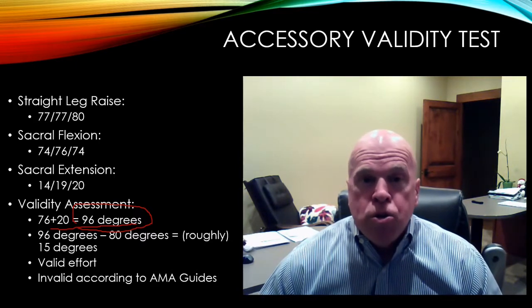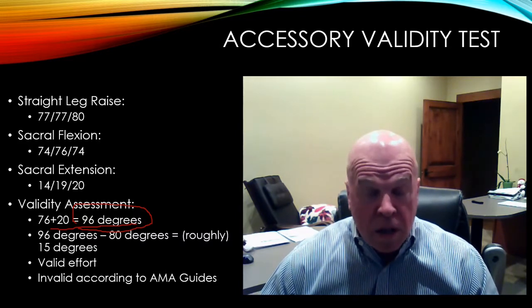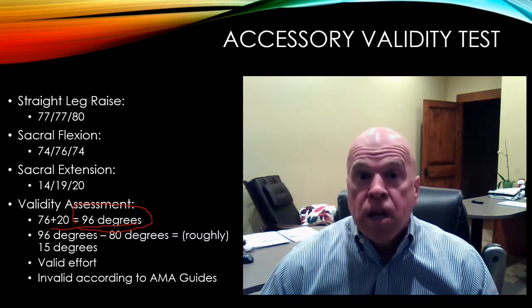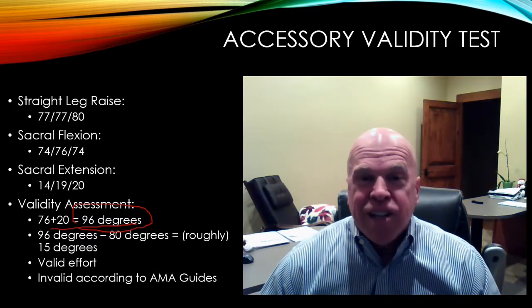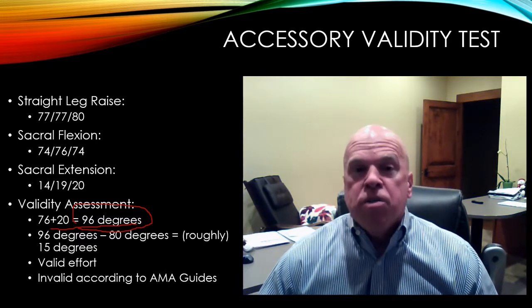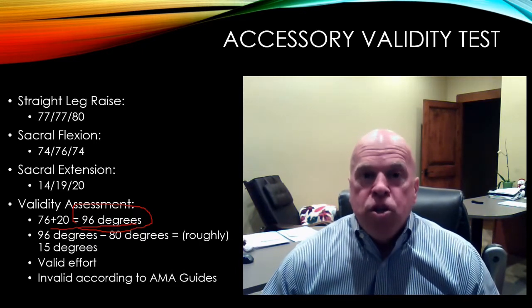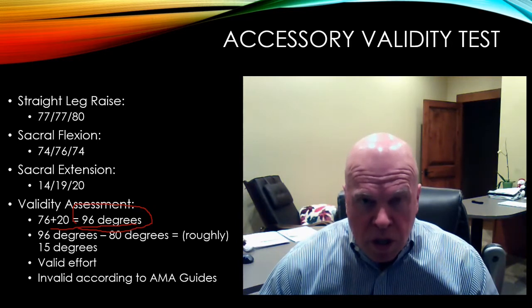Okay, so thus the necessity of employing digital inclinometers, or at least having dual inclinometers, or at least having inclinometers at all. And let me share with you the final reason as to why inclinometers are absolutely necessary in your lumbar range of motion testing.